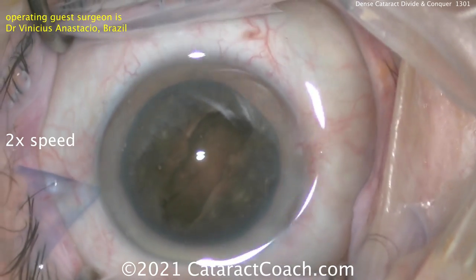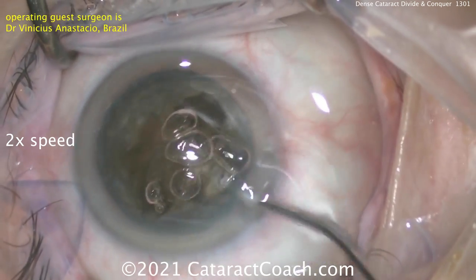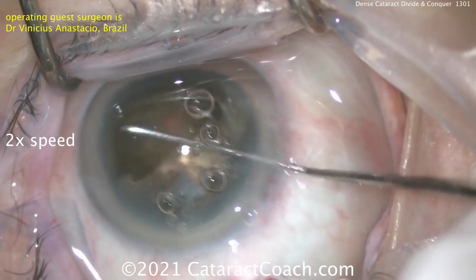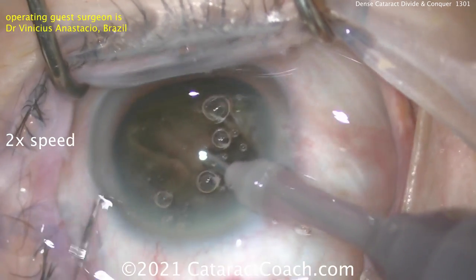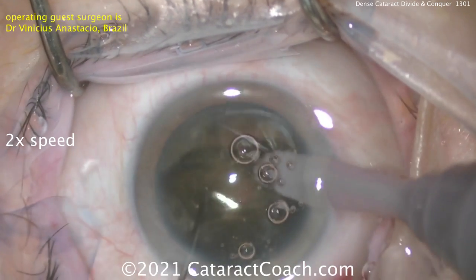Now rotating it back to get more grooving done. What do you think he's going to do now? Of course, more viscoelastic — got to protect that corneal endothelium. Aiming the viscoelastic not into the groove but up towards the central corneal endothelium — that's important. The probe goes back inside the eye, getting a complete split of that first groove.